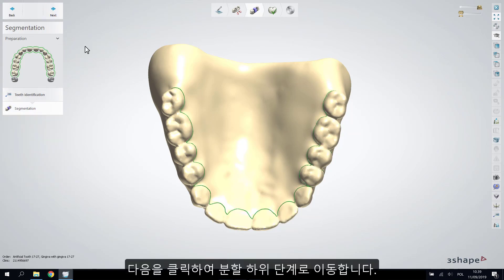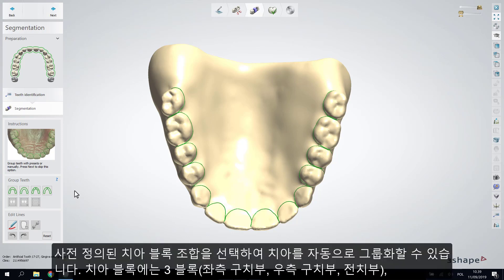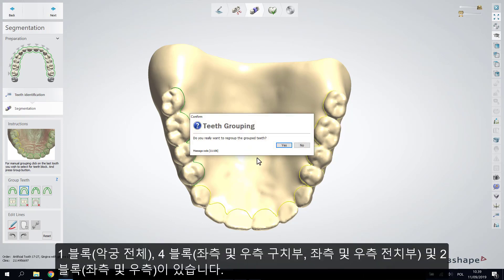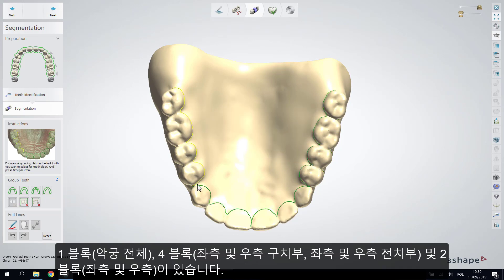Click Next to move to the segmentation sub-step, where the line will be placed automatically on the segmented teeth. You can choose predefined teeth block combinations for the teeth to be grouped automatically: three blocks (left/right posterior and anterior teeth), one block (full arch), four blocks (right and left posterior teeth and right and left anterior teeth), or two blocks (two quadrants).